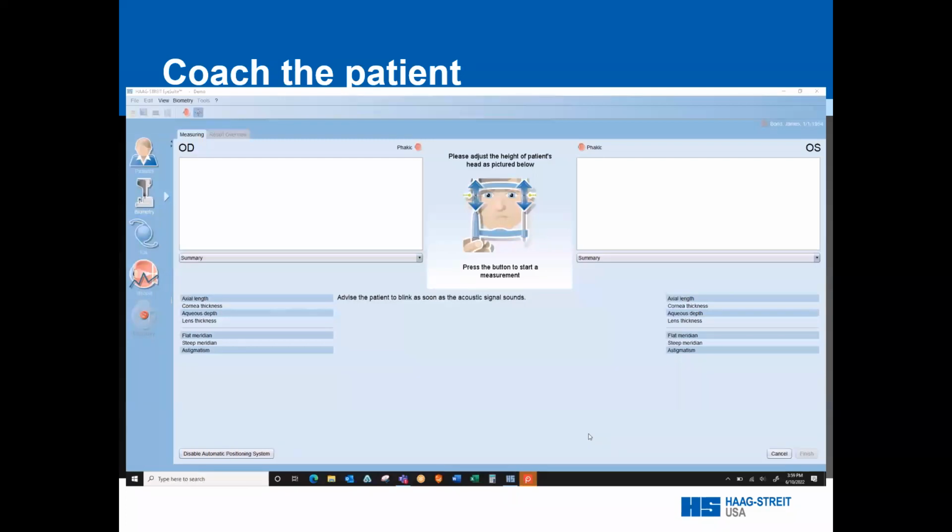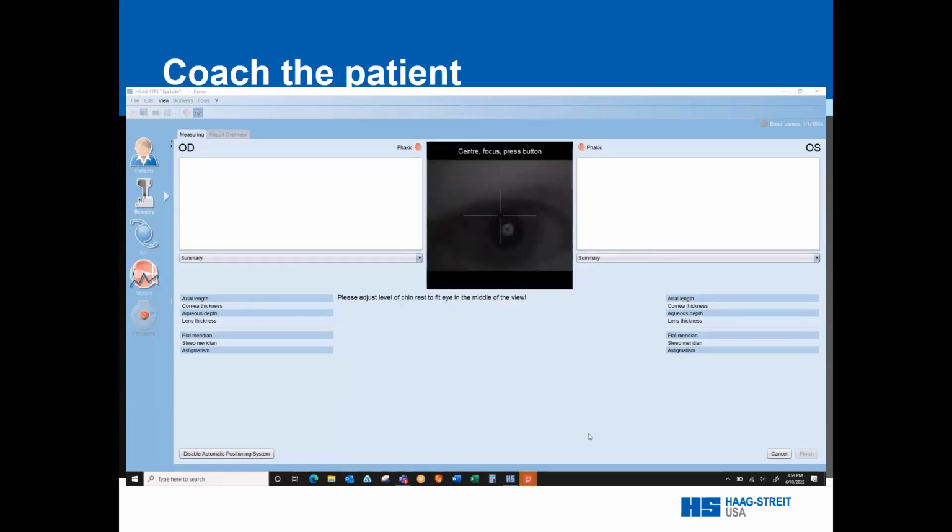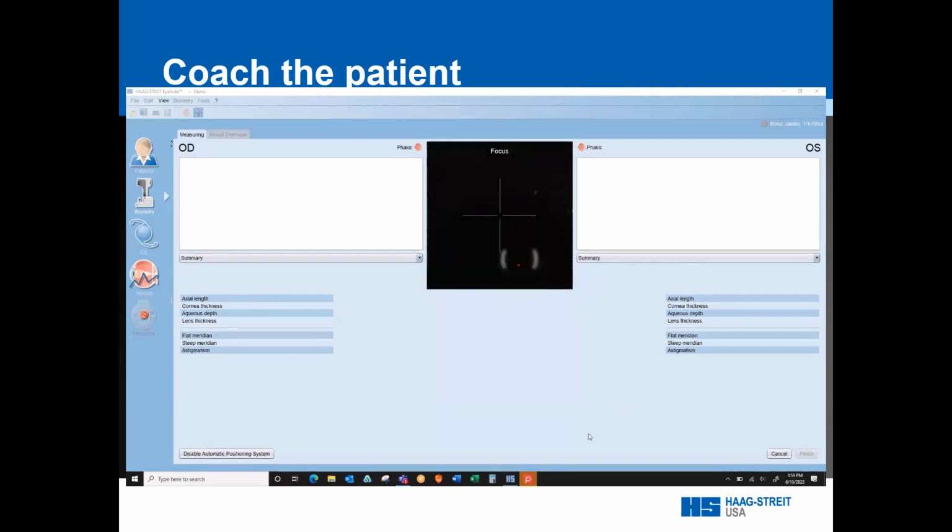So after adjusting the patient, telling them what to expect, I click on the joystick button to activate the camera and adjust the gross focus alignment. Once the dots are good and separated, click again to adjust the fine focus, then moving slightly in until there are double parentheses and the green dot locks in the center. And the Lenstar takes over and begins focusing and scanning on its own.